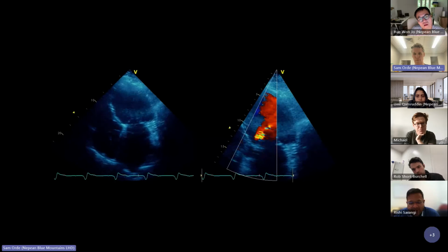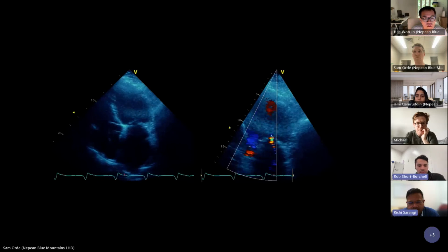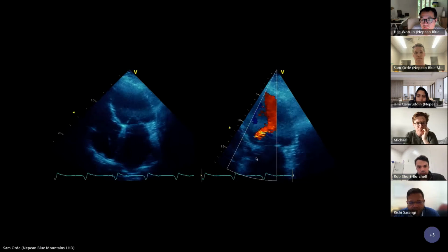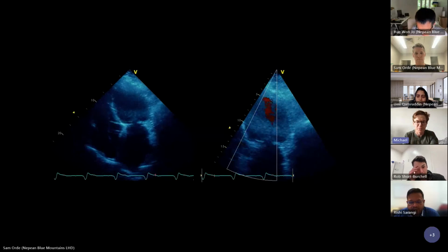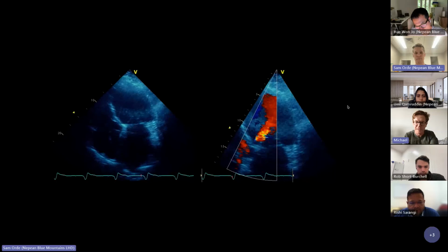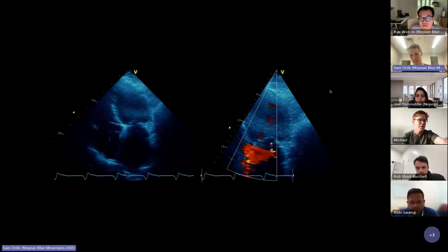Any others? I mean, call from anyone else in the crowd? What else can we do? I guess one thing you talked about earlier, Sam, is the MAPSE. You can see that the longitudinal function in this heart doesn't look good. Excellent. Very nice. Anything else? I guess you would just take everything that you could. Like if you could get an E-point septal separation in a parasternal long, you could do dP/dT of that mitral regurg and just try to put it all together when you're probably not going to measure an EF. Fantastic.